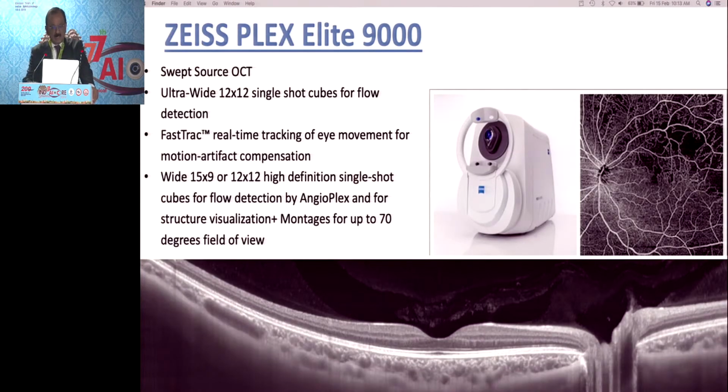And I just want to touch on the PLEX Elite, which is made by ZEISS.